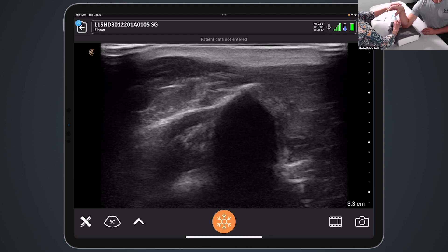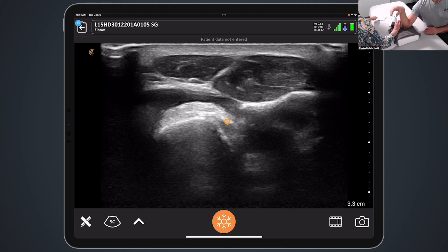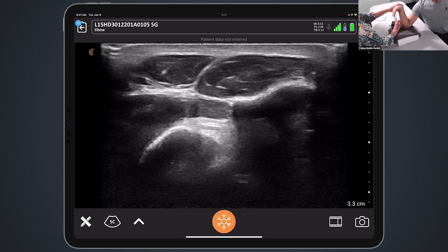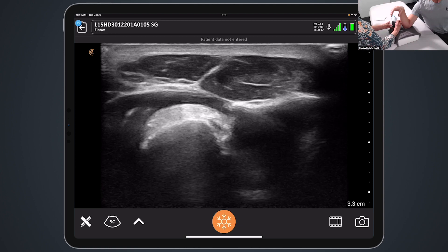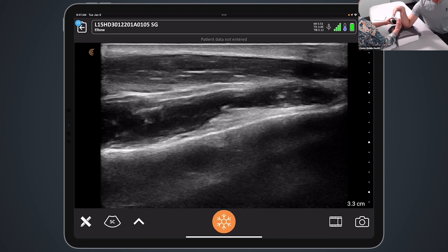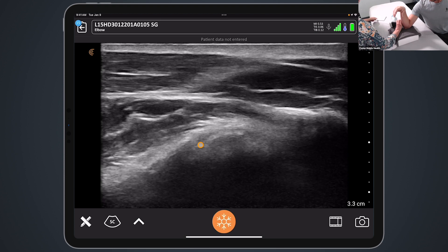The next view is the Cobra — the Kill Bill position. Here we are seeing the radius and we are seeing the insertion. With the dynamic motion, we can see things moving in here. I noticed a little bit of an echogenic thing in the middle — Mark can see it as well. Then rotating the scanner 90 degrees to look at that in long axis — this is also a great view. It's really nice to see the whole overview of the radial tuberosity and insertion, even if I don't get it quite as nicely as Mark just yet — I just need a little bit more practice.